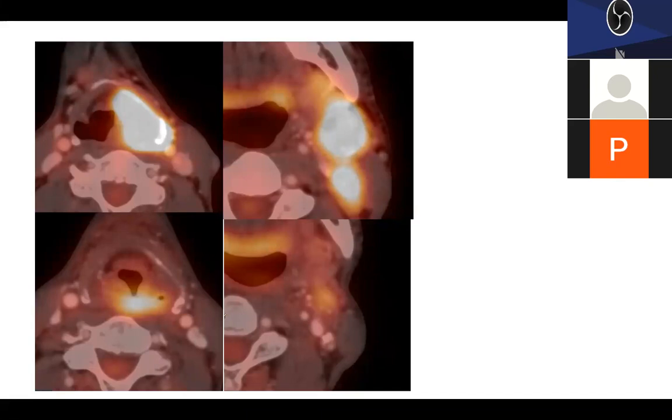However, this is a very non-specific uptake, and for this we should remember that these low-grade uptakes have a very low positive predictive value for predicting residual disease. So many of these might show uptake for a long time, but it will not progress. Some residual disease.